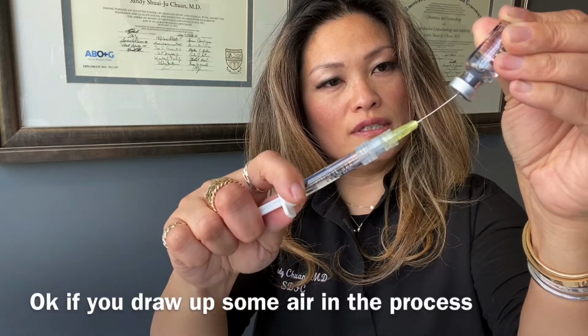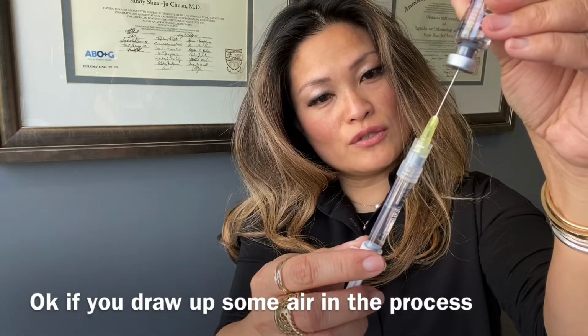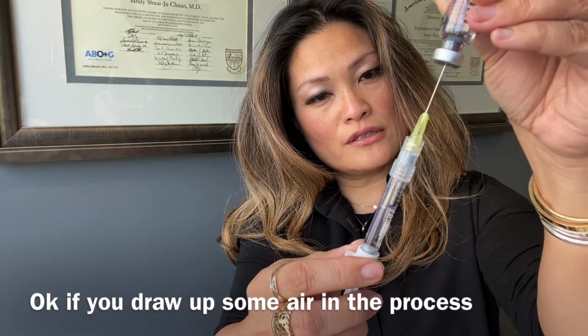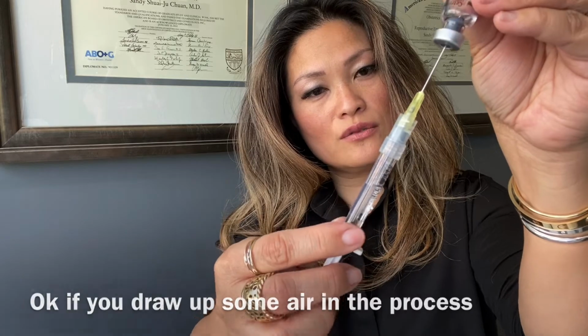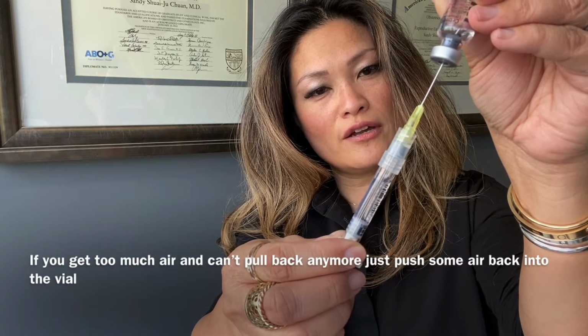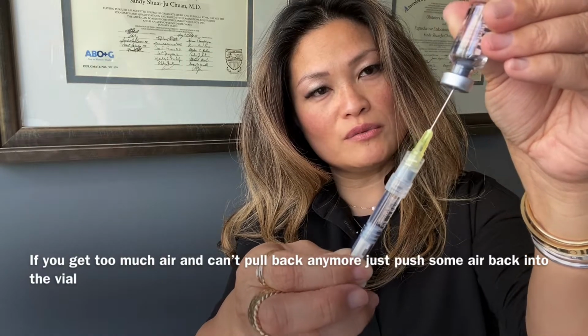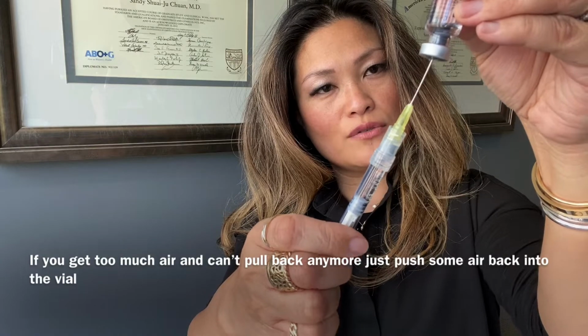And you want to get all of it as much as possible. Right now, I'm stuck with the situation where I think I got some air in it earlier and I got a bunch of air in here. So what you want to do is push that back up into the bottle. You can push the air because the syringe will only go back so far, right? So if you have too much air in it, you won't be able to get the whole content out. And that's where I was struggling.